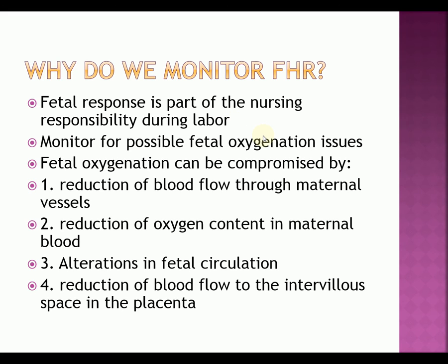These are some of the reasons why we monitor the fetal heart rate. Again, we want to see what the fetal heart rate's response is during labor. Are we using too much of the baby's oxygen, the fetus's, the neonate's? He's a fetus till his feet clear the floor, the perineum floor, that is.